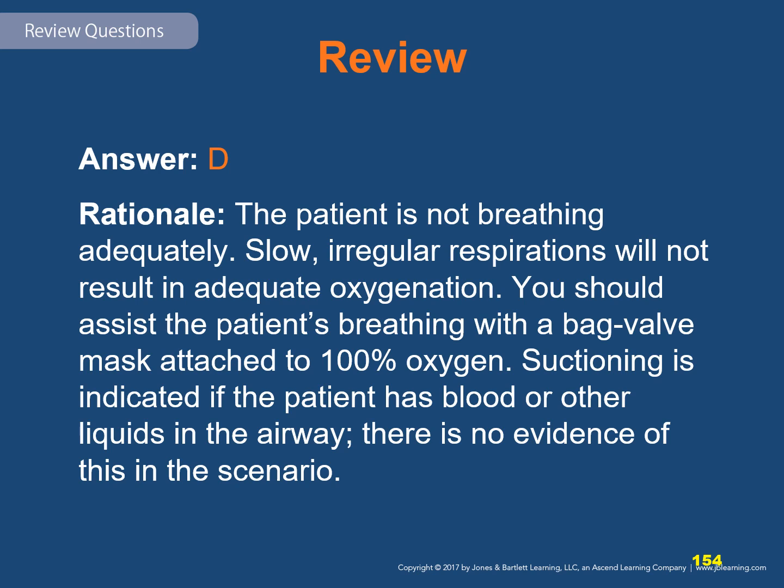However, you also need to remember that when using the BVM, somebody that fell from the 3rd floor is very likely to have head and spinal injuries and fractures. So you want to make sure that you use the jaw thrust maneuver and stabilize their spine.